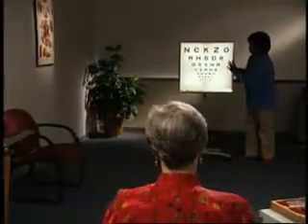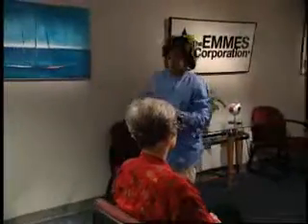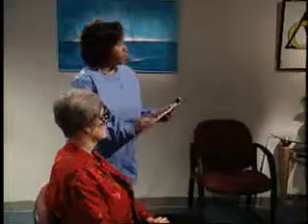When the exam begins, visual function examiners should give the subject the following instructions each time visual acuity is tested, as demonstrated by Lisa Coleman from the Ophthalmic Training and Certification Group at the EMMES Corporation.